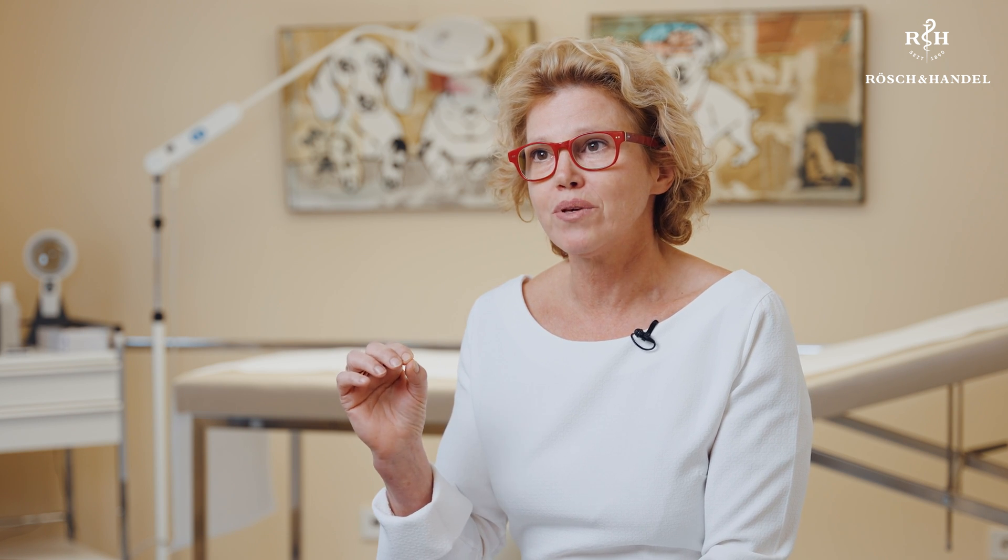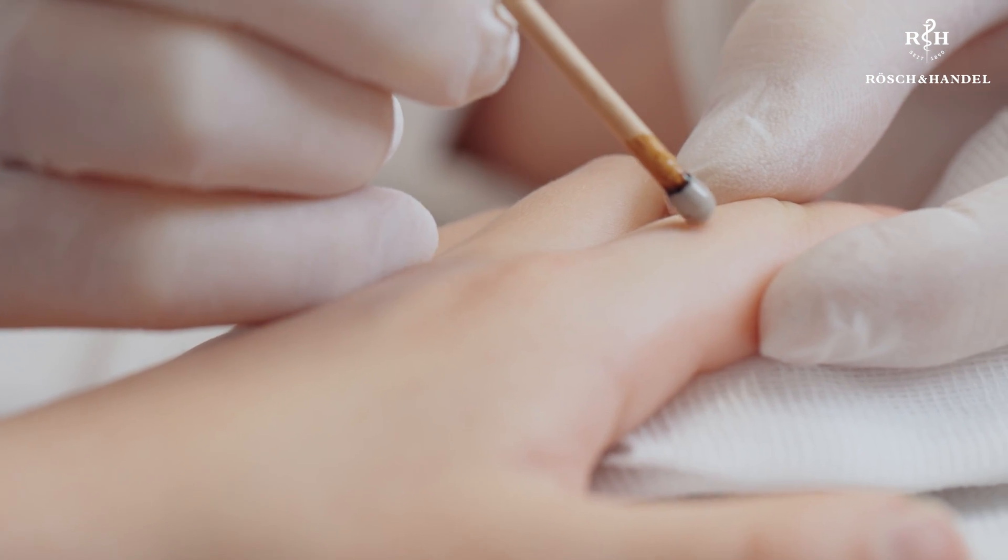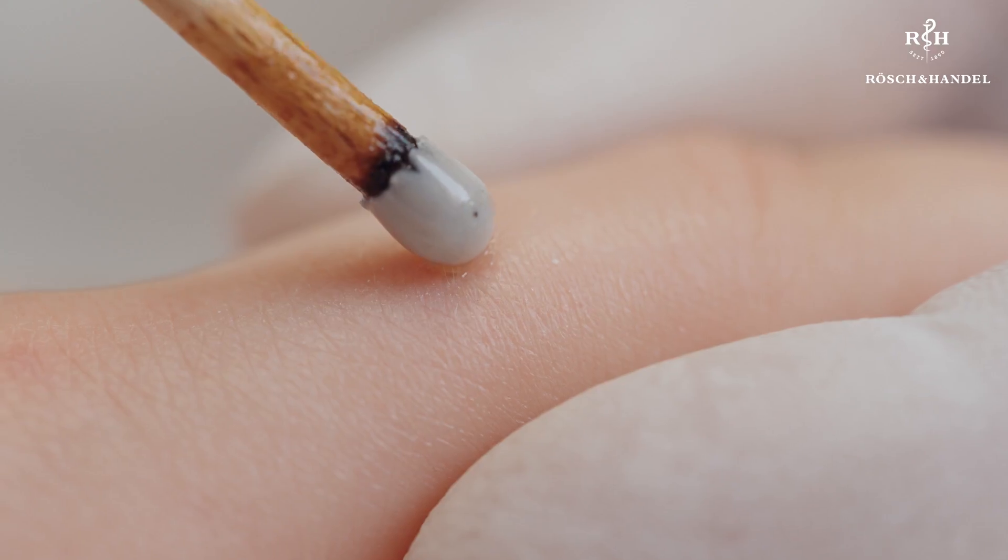The wart should be touched with the tip of this moistened applicator. Treatment only takes a few seconds — all that's needed is to dab once or twice at the wart with the moistened tip, and you're done.